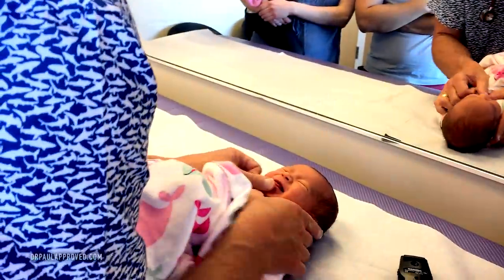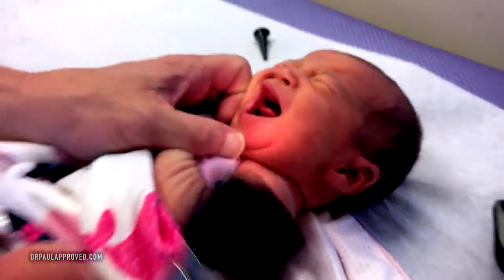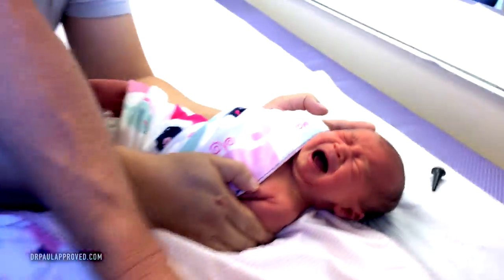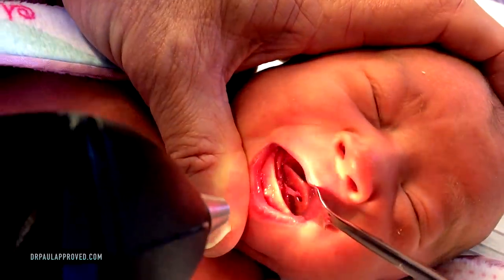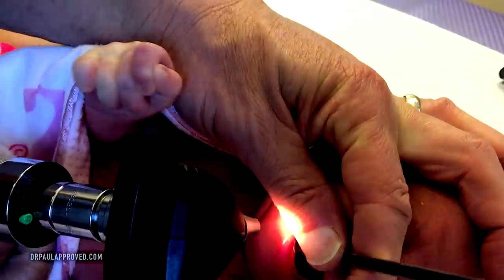Now we're going to get that tongue. We've already talked about the tongue tie — this is a minor membrane. You can see it right underneath the tongue. There's that membrane. We're just going to flip that. I'm going to actually use this little retractor. There we go — got some of them up there. There's a little more I could get, but I got enough. We're good.